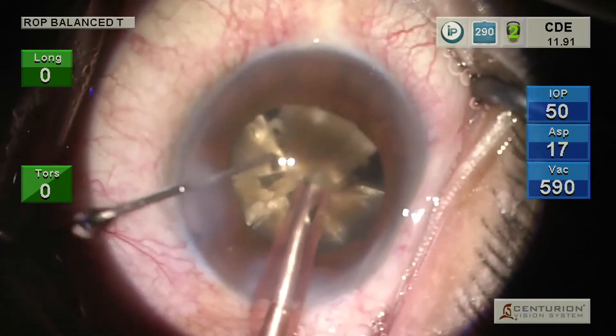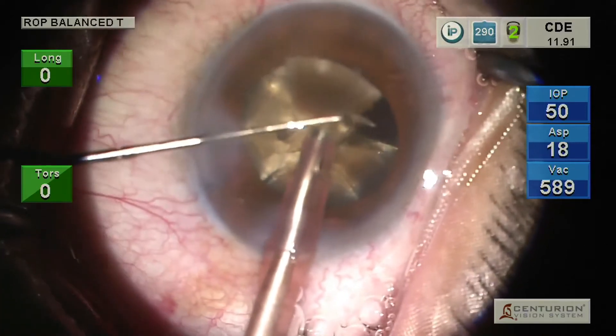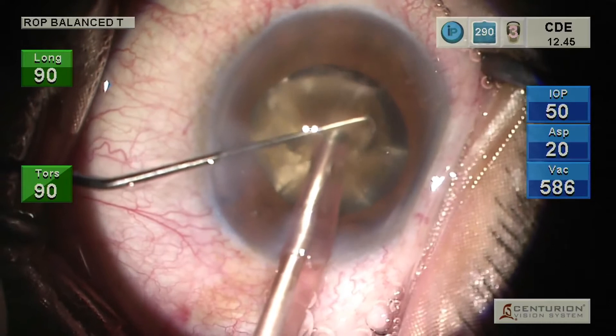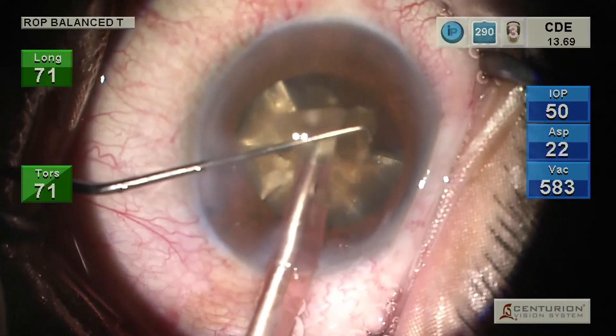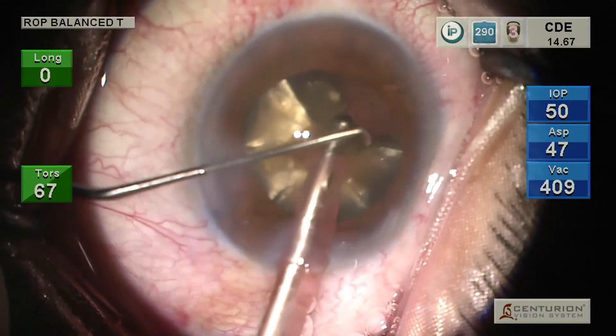The chopper is intermittently used to rotate the nucleus and maneuver the fragments towards the phaco tip, while it maintains the protective shielding function above the phaco needle during actual emulsification.